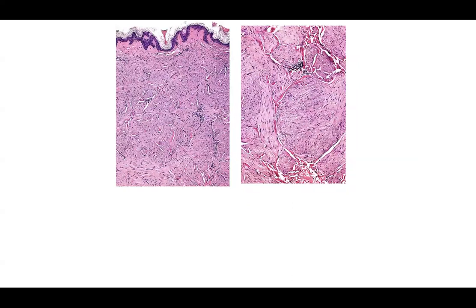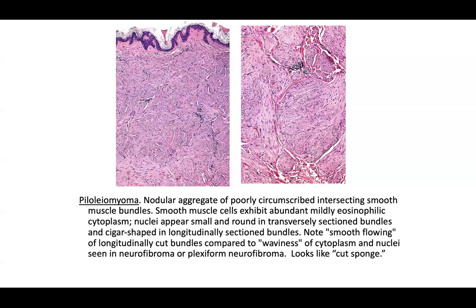Inflammatory or neoplastic? Depending on the site, you may think this is smooth muscle, since sites like the areola, nipple, and scrotum typically have smooth muscle bundles. You see fascicular architecture with elongated nuclei within strands — a smooth muscle bundle appearance that is ill-defined. If neoplasm, consider a piloleiomyoma — leiomyomas derived from the arrector pili muscle — or an angioleiomyoma derived from vascular smooth muscle.